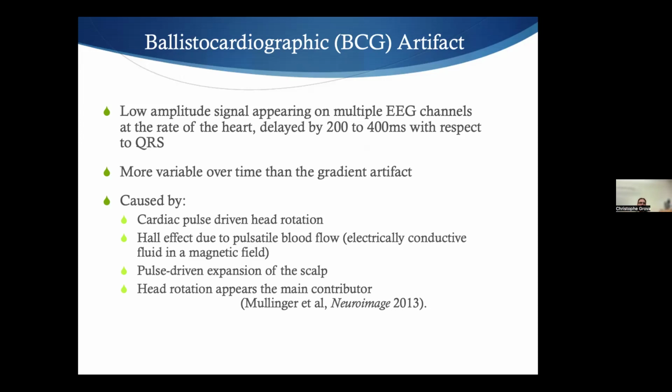And actually, it's very nice because you can synchronize your fMRI scanner to that to follow. So they've been showing that if you do that, the scanner can follow you. But not all systems can do that. But what Pierre showed there is by doing that, he recorded the ECG, and then he amplified the motion. And then he showed specifically that we really had a motion like that after every heartbeat. So it's tiny, but it is there.